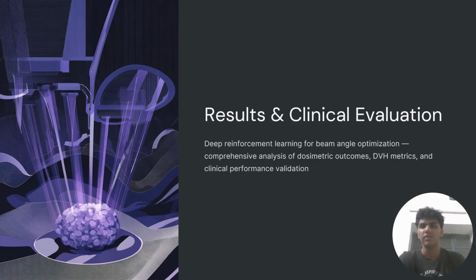It is being evaluated on cases which it has never seen before. So the goal is to measure how well the agent will generalize across diverse anatomical variations and planning challenges.